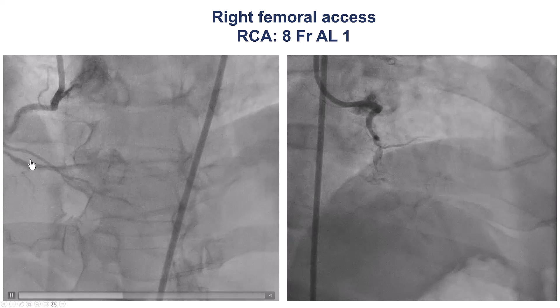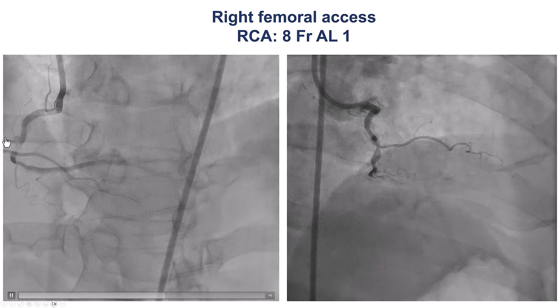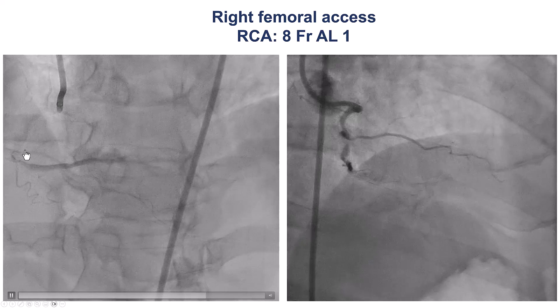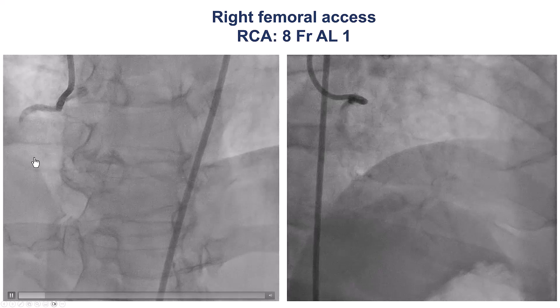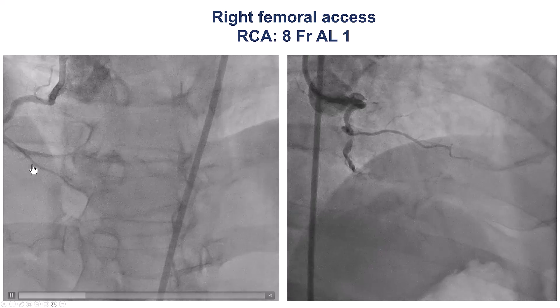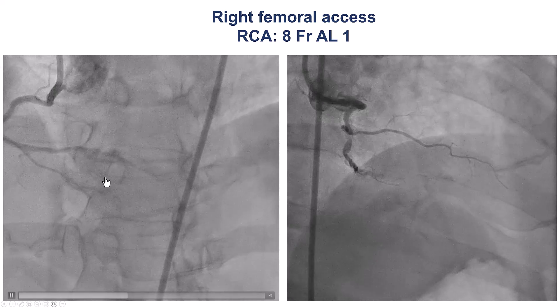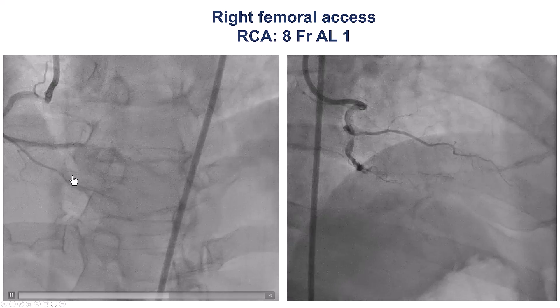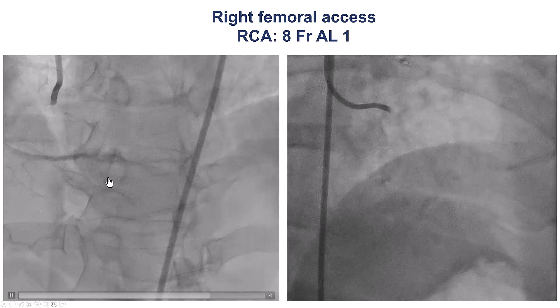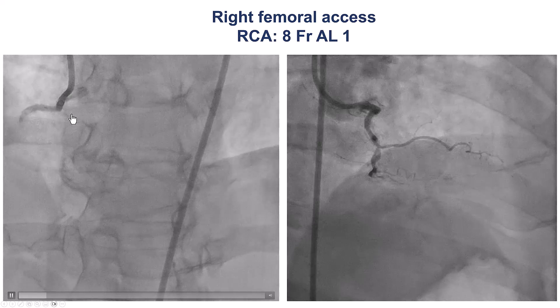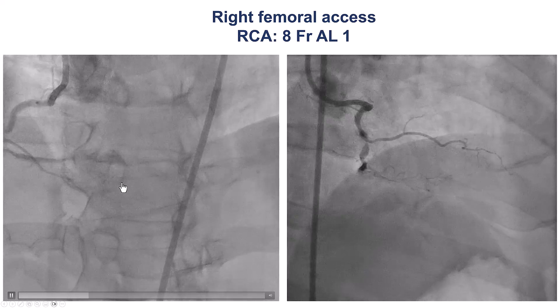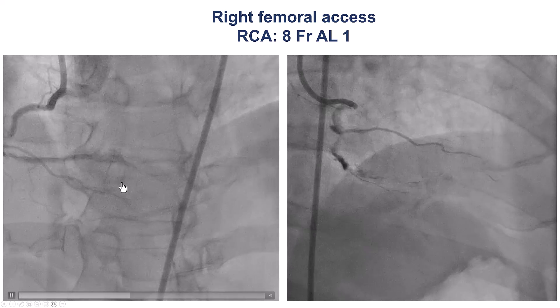There is heavy calcium. It looks almost like a total lesion, but there is antegrade flow. The distal vessel also has some calcification and a distal lesion. The flow is TIMI 2.